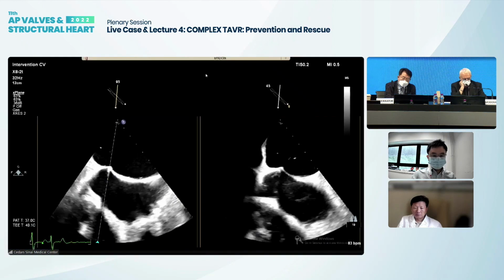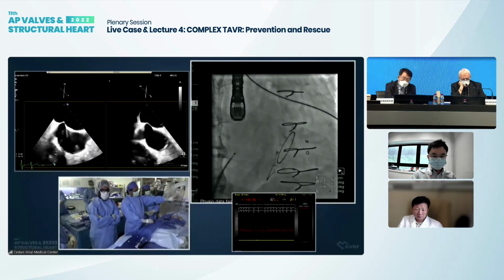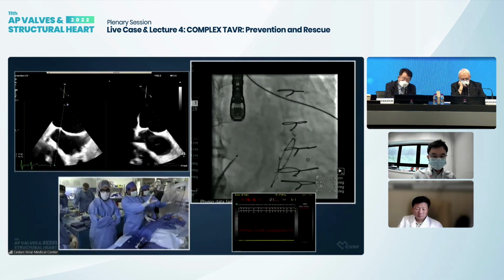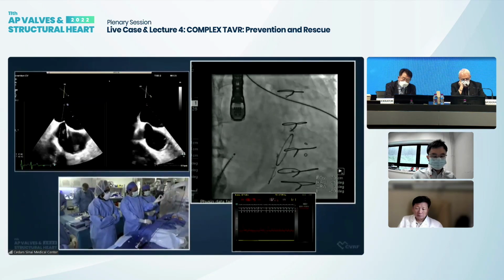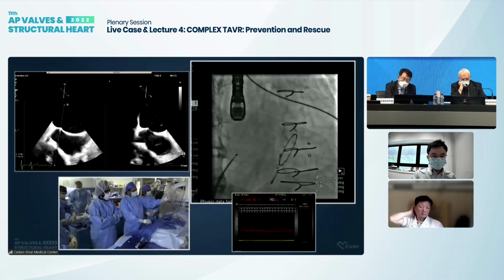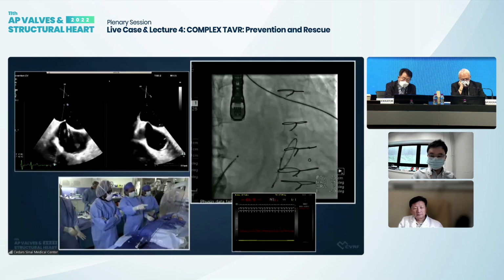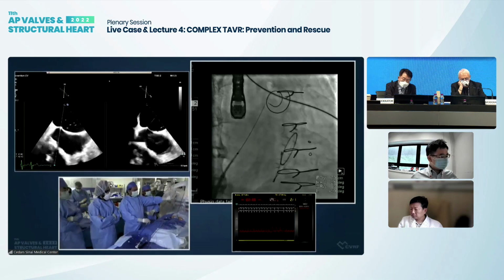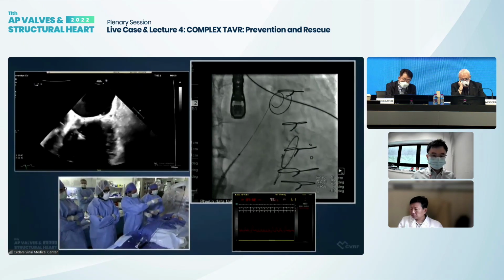What Moody is showing you here, before we started that case, we were in this room. On the left in fluoroscopy, you are looking at where the tip of our needle is. We use that as a guide, because imagine that circle of the valve. You are aiming towards the septum there, and you can imagine what the pathway of the wire and the catheter would be. If you are very high there, then you are too high and you're going to get in serious trouble.